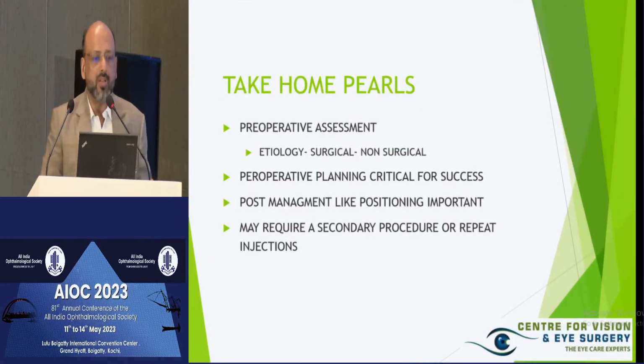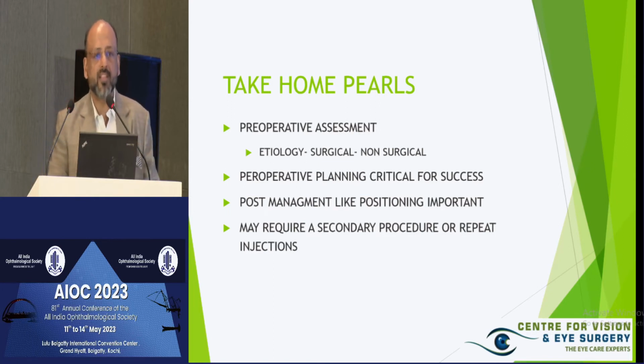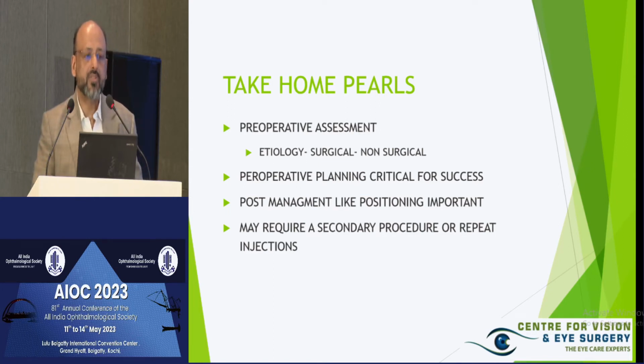Just to reconfirm the take-home pearls, you need to have a good preoperative assessment. You need to look at etiology. Remember that surgical and non-surgical etiologies are different. Per-operative planning, especially with respect to the site of the incision to insert your descemetopexy cannula, is important. Post-op management, like management of the positioning, is important, usually 2 to 3 hours to make sure that the tamponade is effective.